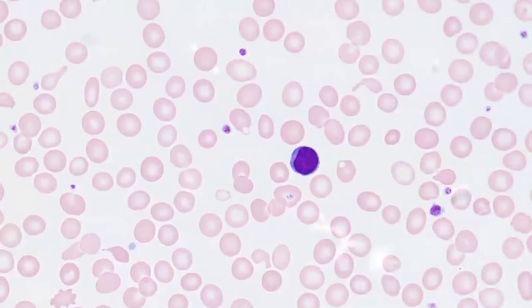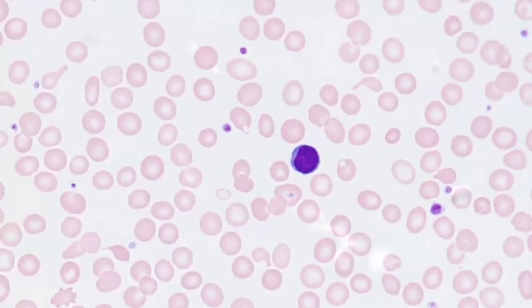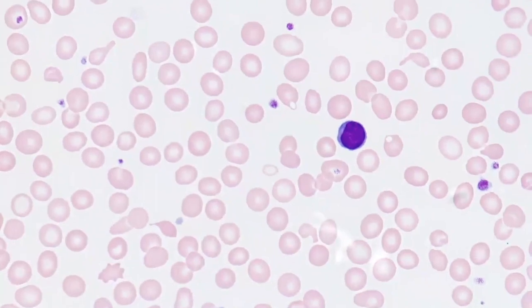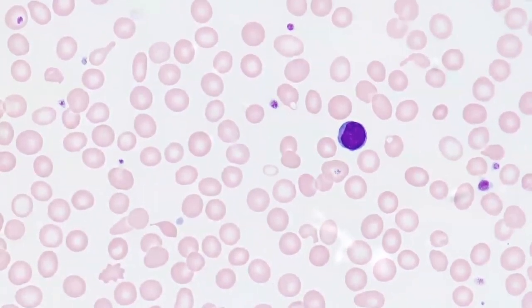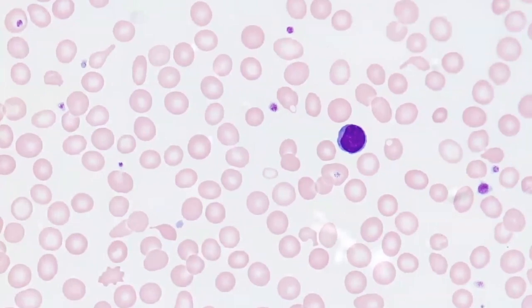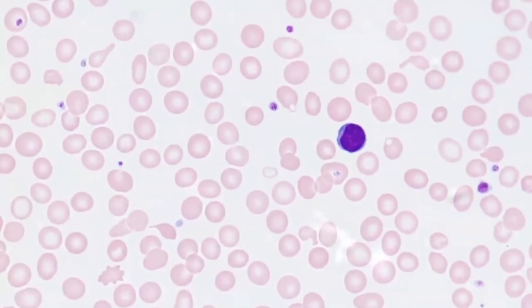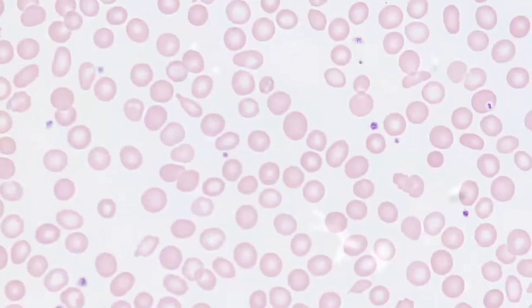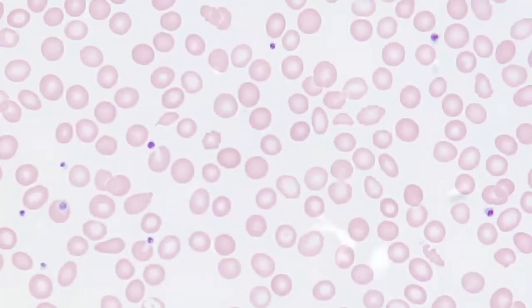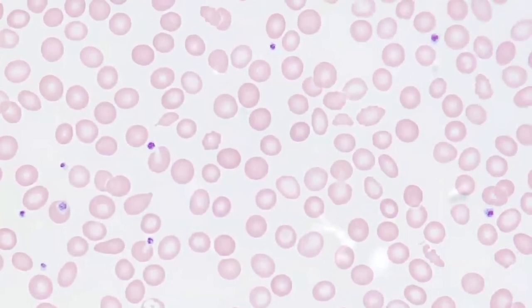Some other things that you can see in the red cells of people with iron deficiency anemia is increased central pallor. This is most evident in these smaller cells. This one seen in the center shows more than 2/3 central pallor, I would say, whereas what we want to see is about 1/3 central pallor and the remainder of the red cell showing no pallor.